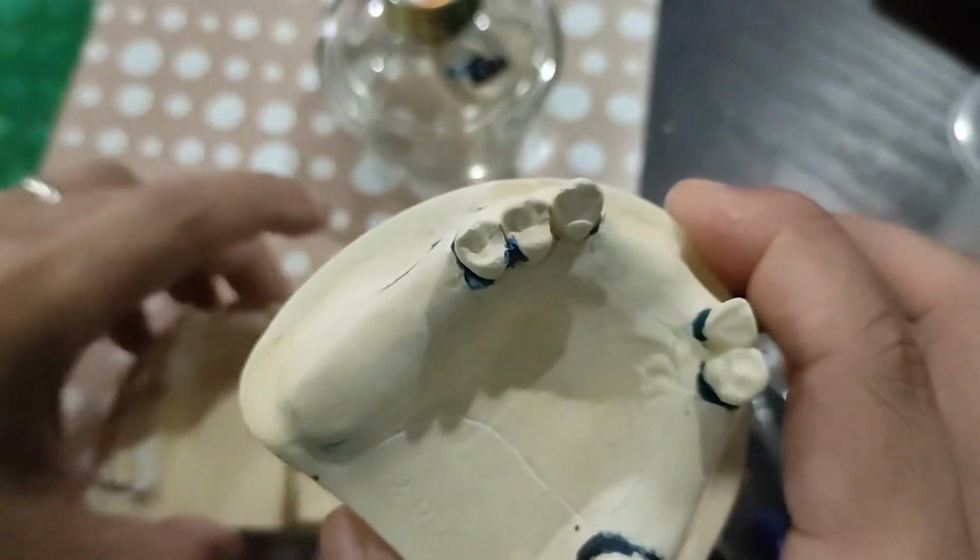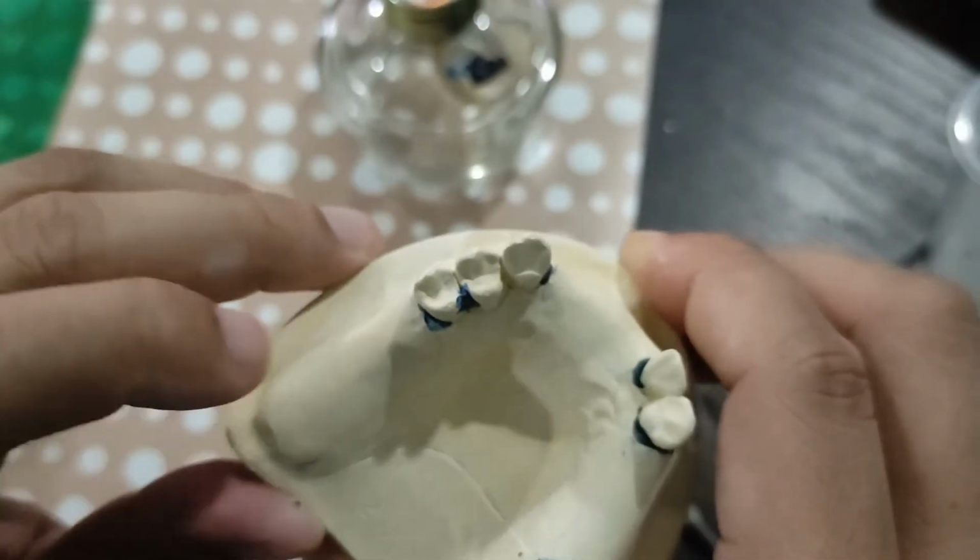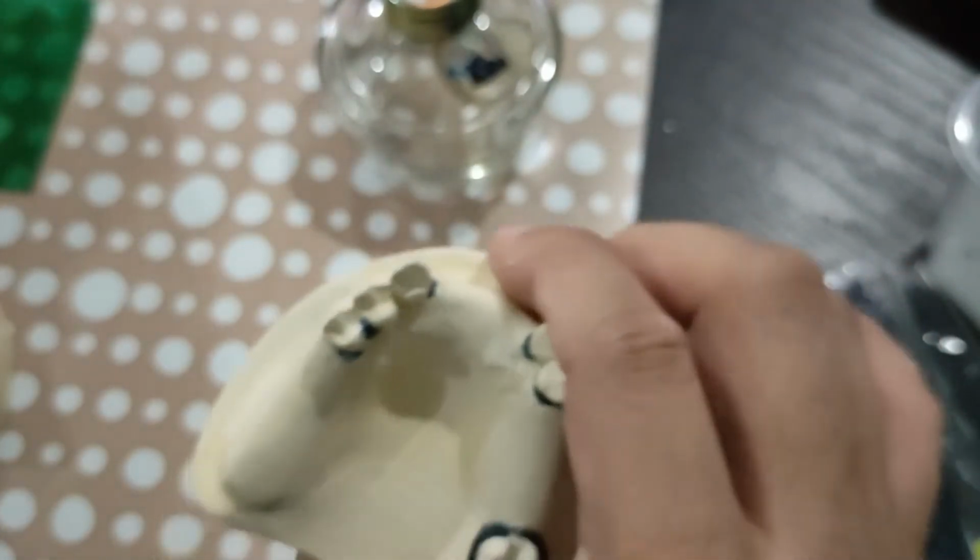Next is we're going to place the relief over the denture base areas. For the upper, you just need one layer lang. Okay?